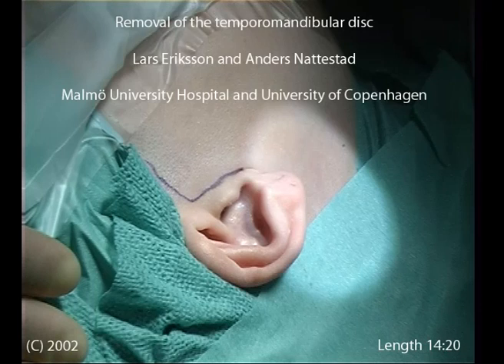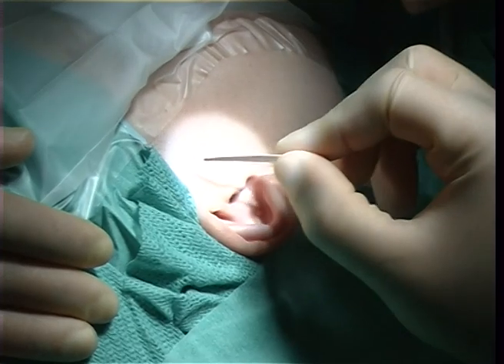We are now going to see a discectomy of a right temporomandibular joint where we have a disc displacement.